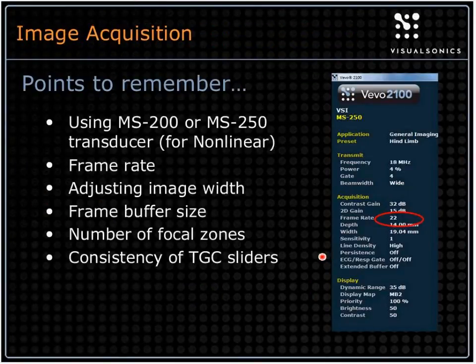So we'll move into a little bit of details now for people who are actually using the system. I just wanted to give you guys some pointers and hints about image acquisition. Being a powerful, sensitive post-analysis package, VevoCQ is really beholden to the type of data that you feed it. You really need to feed it good quality images if you want to get good quality data out of it.